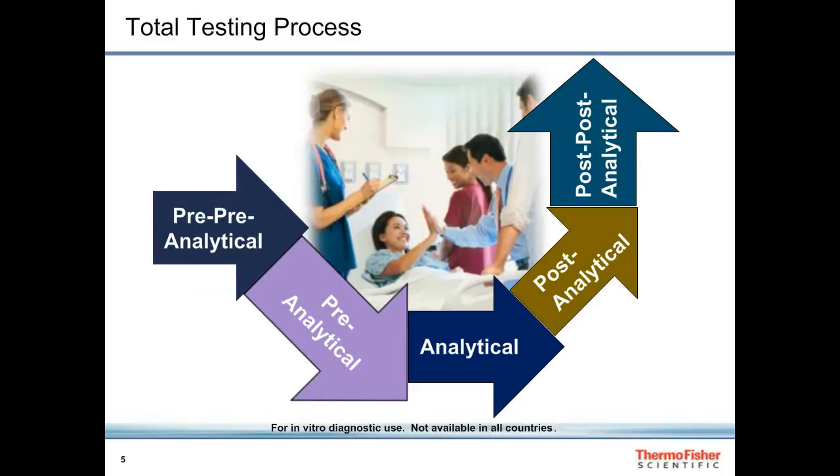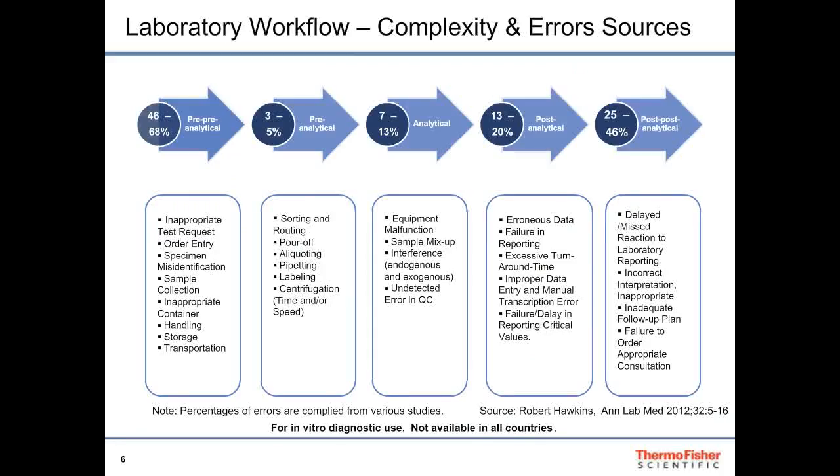The total testing process in clinical laboratories is a patient-focused process. Every bioanalytical test has several critical parts that must be well defined and accomplished in order to produce a credible final result. There are things that must happen before samples arrive in the laboratory. The highest percentage of errors occurs during this time.